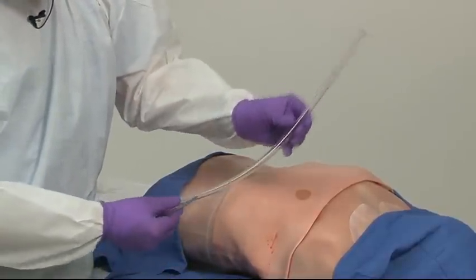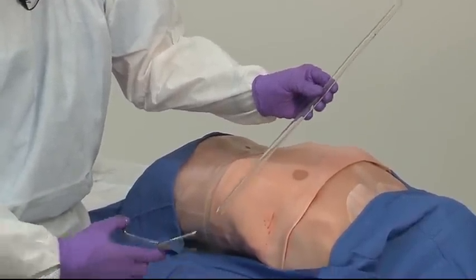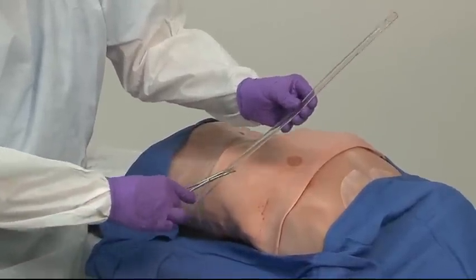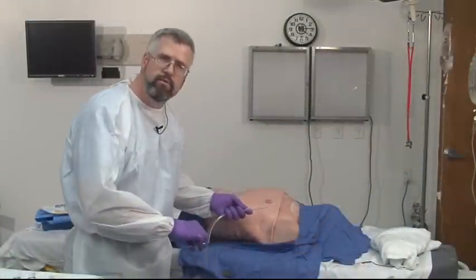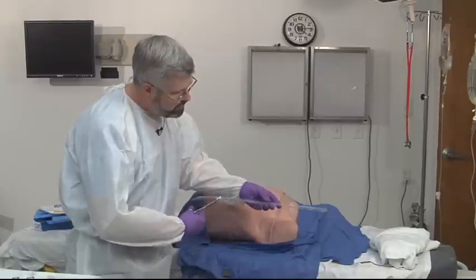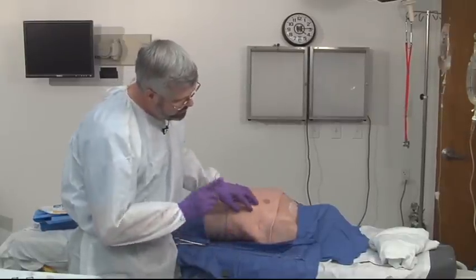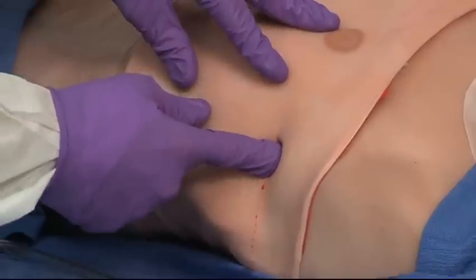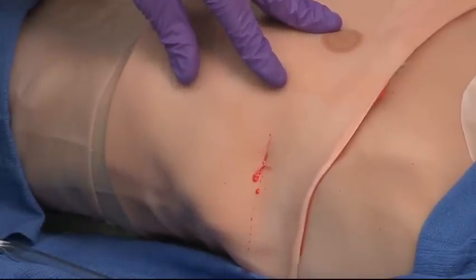The other little trick here is that you want to make sure when you're putting this in for suspected blood that you clamp the end of the chest tube, because if you stick this into the chest and there's blood in the chest, it's going to come out all over your shoes. So we've got our chest tube ready, we've got it clamped. Now we're going to go ahead and put our finger back on the bone and feel it. We now can feel the bone underneath our finger here. We're going to take another large clamp.